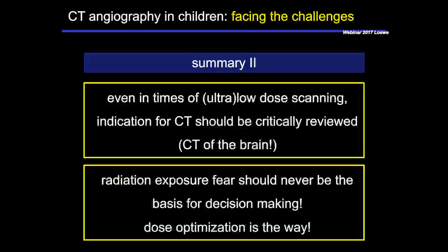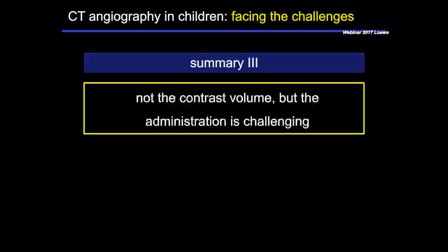Of course, the indication should still be critically reviewed, so especially CT of the brain is an issue in children, but radiation fear should never be the basis for decision making. Dose optimization is the way. If there is a clear indication, optimize your scan, and of course do the scan, with no hesitation and no fear. Again, it is not the contrast volume in children that is the challenge, but sometimes the administration.